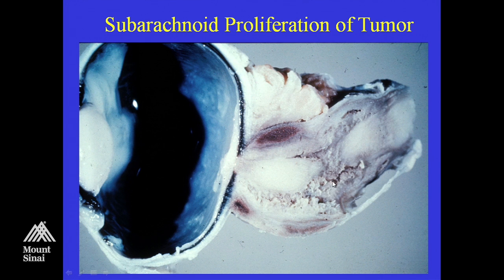And there's been a bit of controversy, and perhaps some ongoing controversy over the years, as to what this proliferation in the leptomeninges is. Particularly in older reports, they refer to this as meningothelial proliferation, and indeed, you can see true meningothelial proliferation out here, but in the 50 or 100 true optic nerve gliomas that I've looked at, I would say more frequently it's actually glial tumor cells proliferating out here in the coverings and distending. So you can see both, but I think more often this is going to end up being glial tumor than leptomeningeal cells.